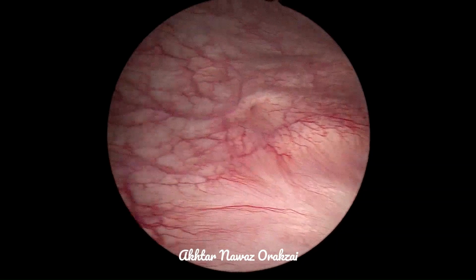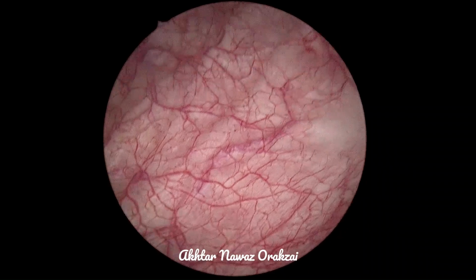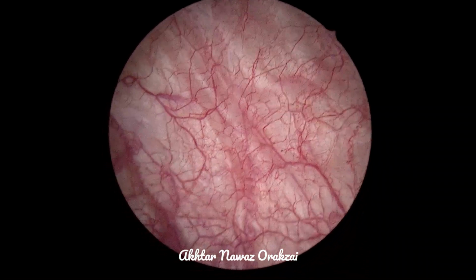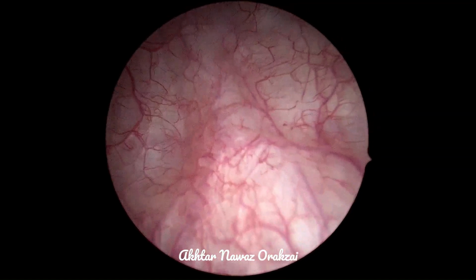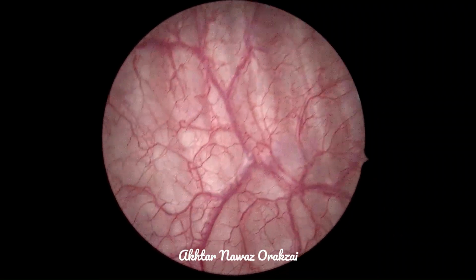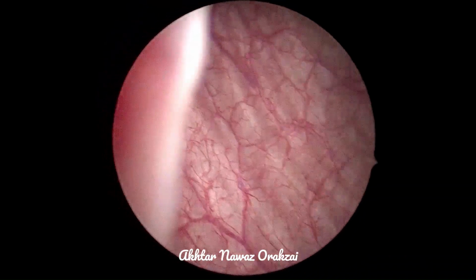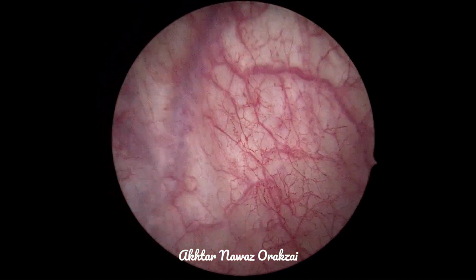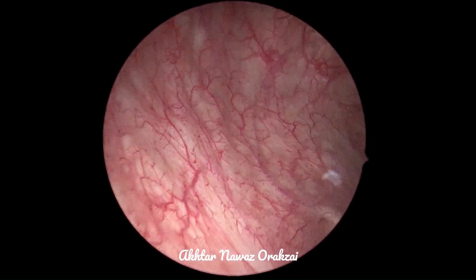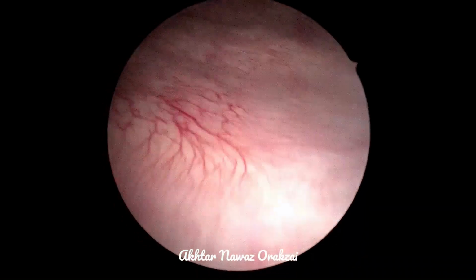The aim of this recording and this procedure is to show the trainees, the residents, and the new fellows, the fresh fellows, how to do a Check Cystoscopy. We have to see the posterior wall completely. We have to be away from the mucosa. Here you can see that we are looking from up towards down, and then from down towards the upside, keeping in view the wide view of the right lateral wall.